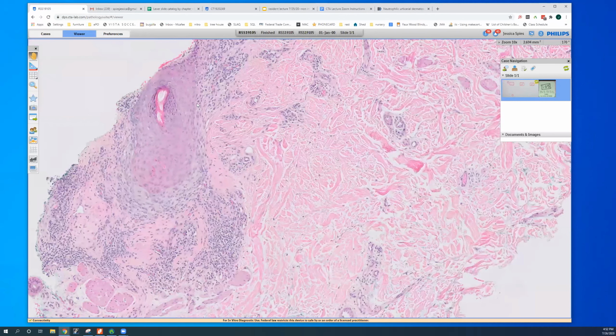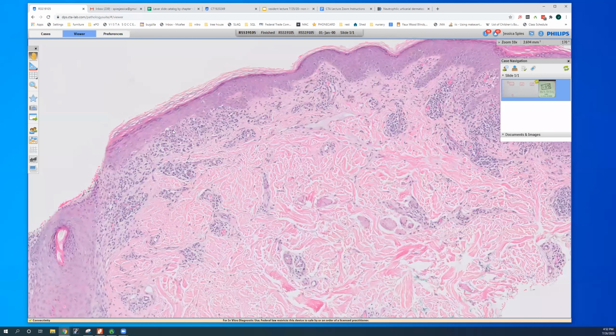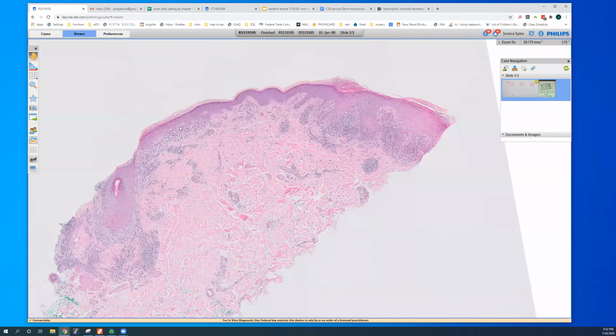Now, if this is on the scalp, maybe this is lichen planopilaris. We've got a perifollicular scar here. And this is in our study set as lichen planus. Other things you might want to think about in the LP-like histologic pattern would be lichen planus-like drug. Probably not collagen vascular disease. Don't usually have this kind of jagged rete.